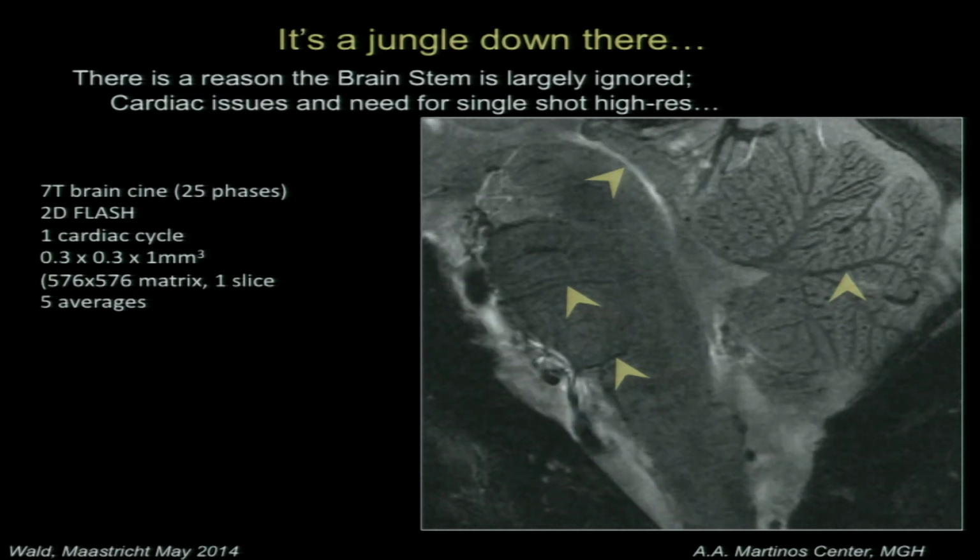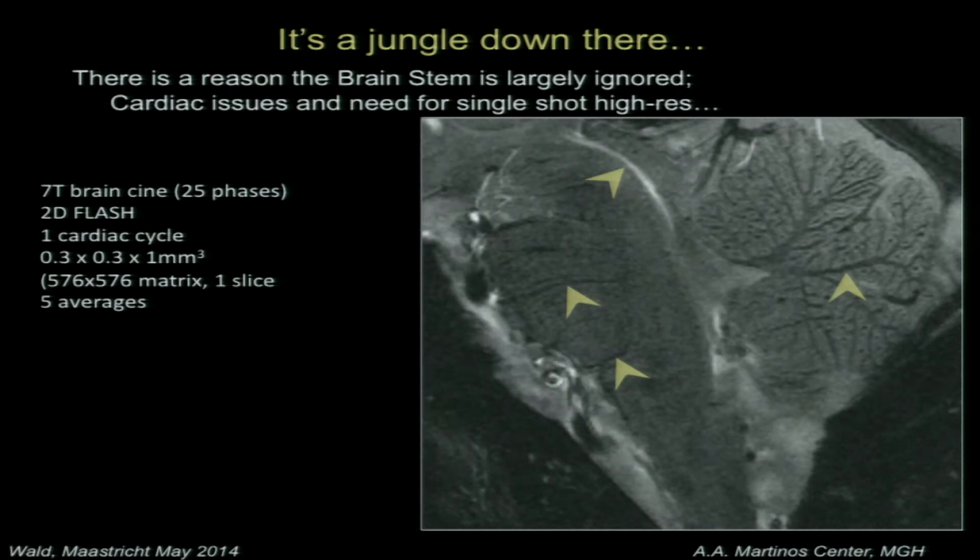And I think that those waves of modulation are likely due to breathing and other aspects. And of course, you see the swirling CSF that just goes crazy all around. And you could imagine subsampling this at 3 millimeters, you would get crazy partial volume changes that would perhaps fool you into thinking it was motion.